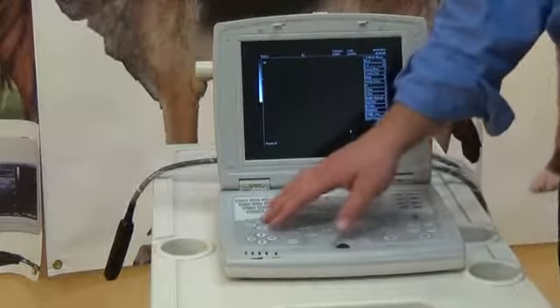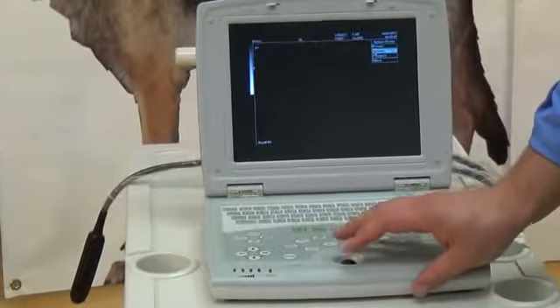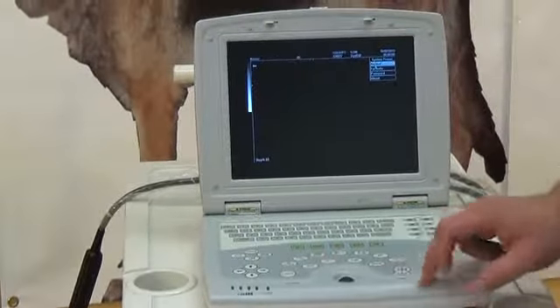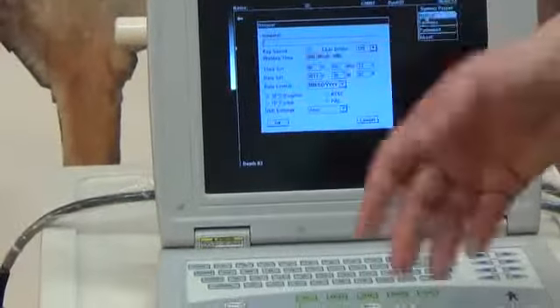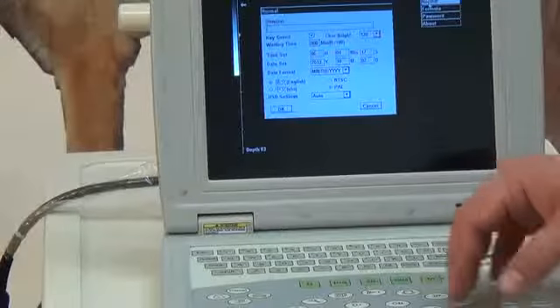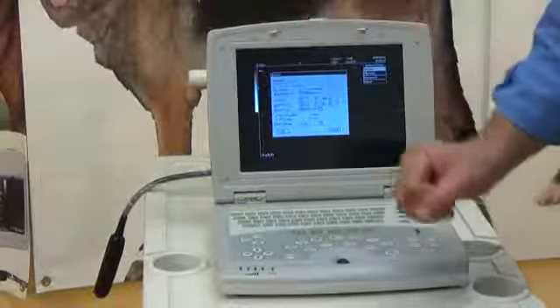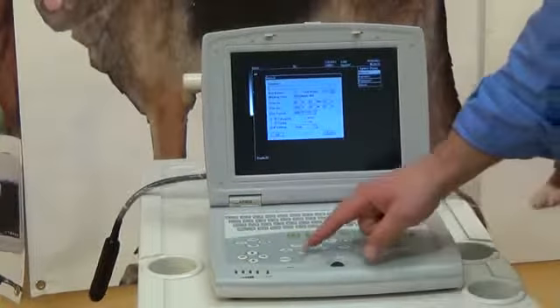So we'll start out with the preset button. This allows you to change things like your formulas for OB settings. If you select the normal part, you could put in like hospital name, change the date, the time, language settings, and then how you save via USB. Usually we set it to auto, so it automatically goes straight to your USB. That's what most people prefer for saving images.